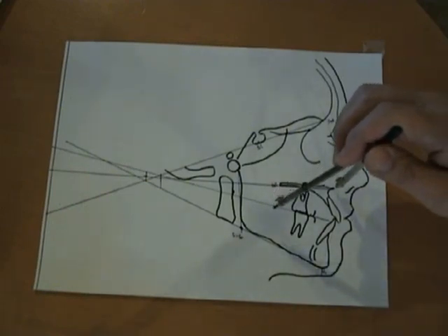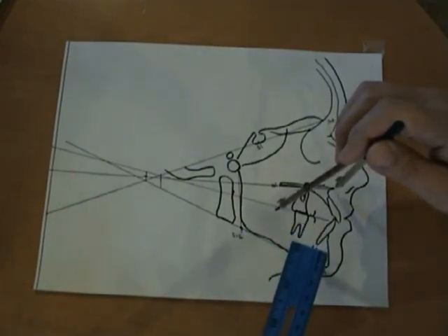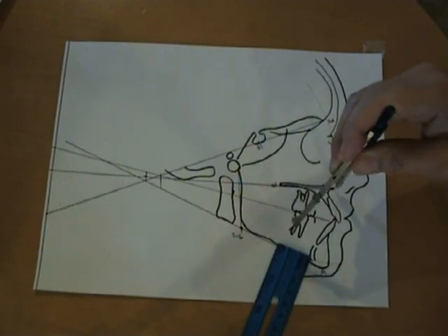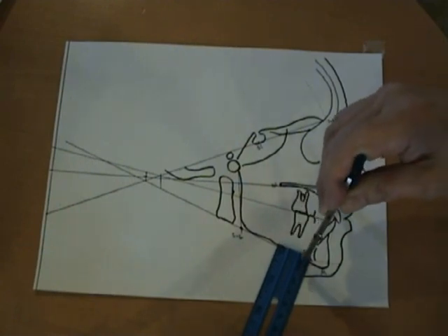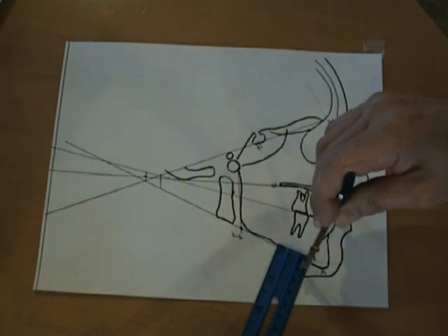Now get a ruler with a millimeter measurement and strike an arc 10 millimeters inferior to the first arc.